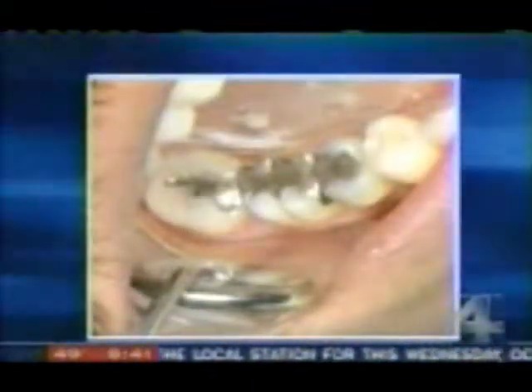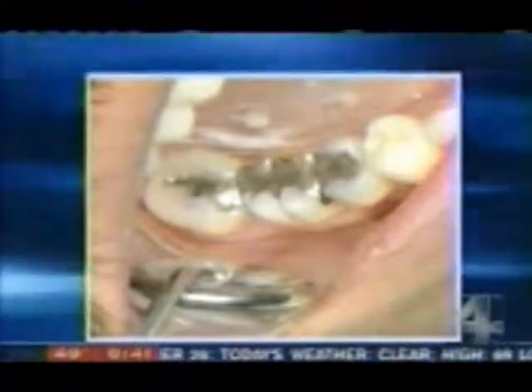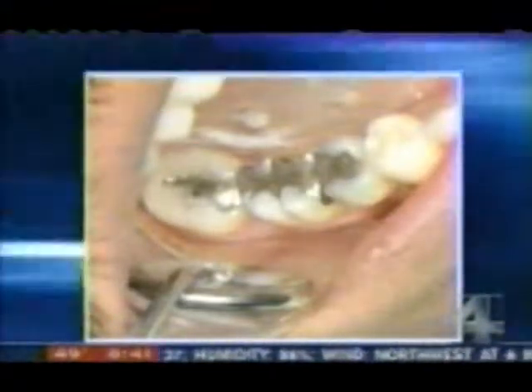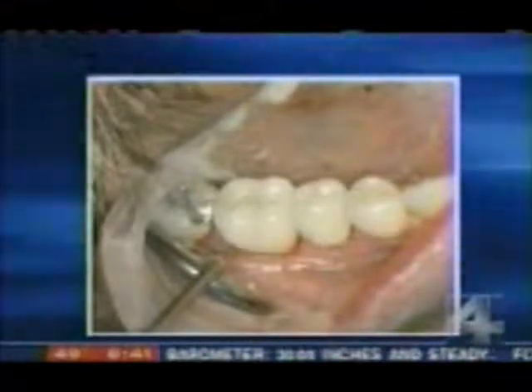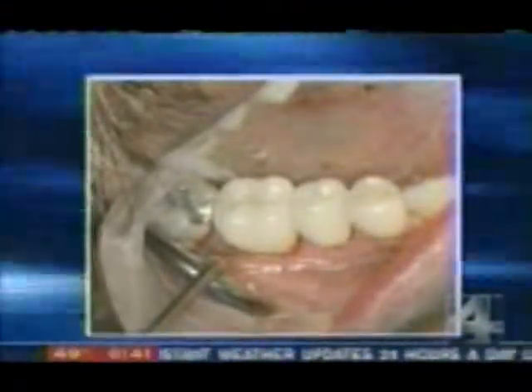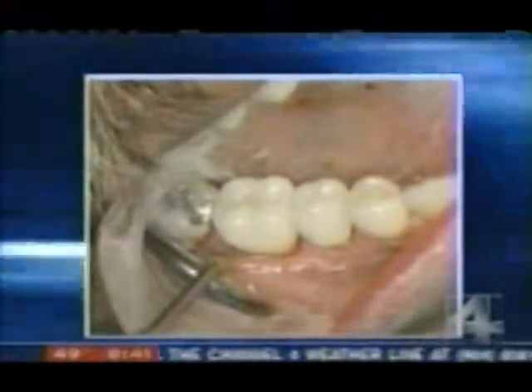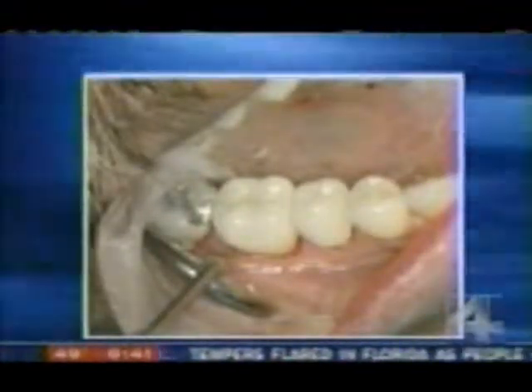What are we looking at here, Scott? I brought a range of pictures here just to give people an understanding. We can work on simple, small areas. We've got 2 teeth that we're looking at, 2 big silver fillings, and the very back tooth we did not treat here. But this is done with a CEREC machine. This is 1 visit. This is an all porcelain restoration. It's actually 2 of them back to back. And the technology that we have available allows us to do some of these things in 1 visit. This isn't for every type of patient, but in certain situations we can definitely use it.